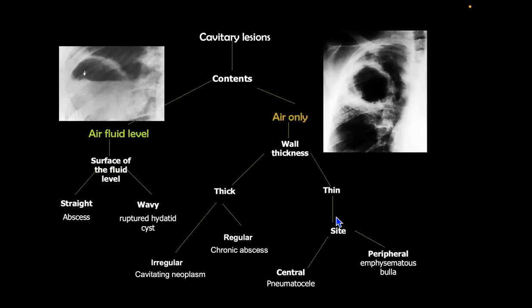For example, in pleural effusion, we do the chest ultrasound to tell whether this is empyema or anything else, and at the end of the day, we aspirate it. So it's complementary rather than the first test. The first test for ambulatory, moving patients is still the chest radiograph. But the ultrasound, we do it just to complete the picture and to answer certain questions.